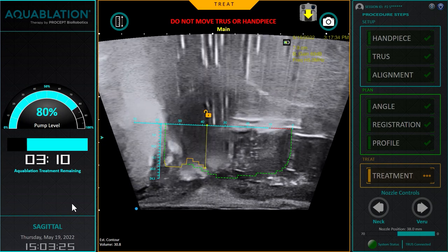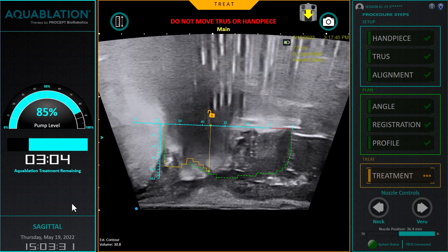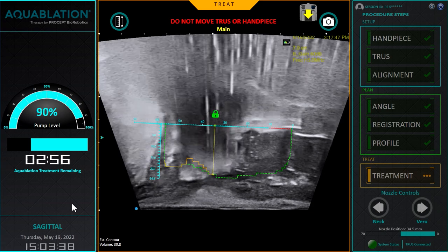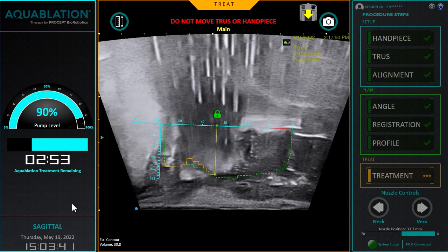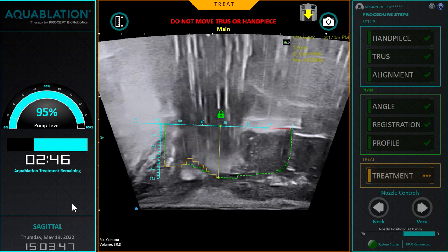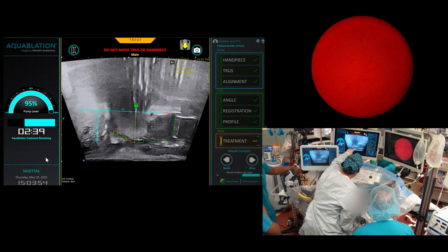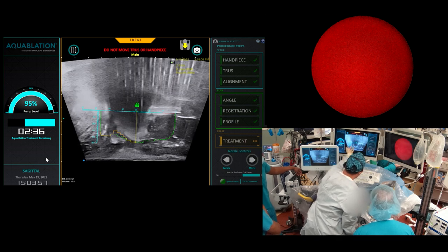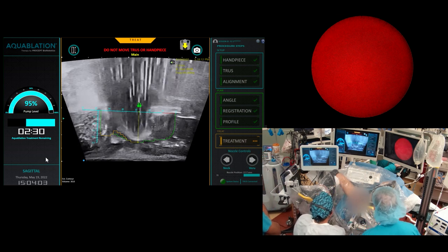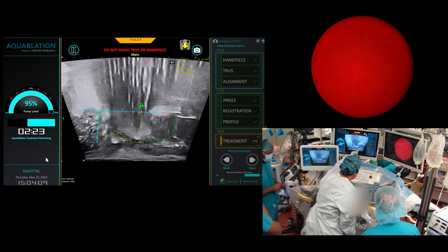I can back off. It looks awesome — you can see the water jet going right where we predicted it would go, and this tissue is just being obliterated. Coming down nice and easy. We're at 95% pump level, two and a half minutes left, and then we're done. This is just gorgeous. I predict we're going to have some tissue here — we'll go back in and scope. But this whole middle aspect of the prostate is just wide open.